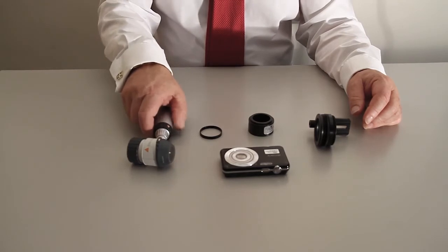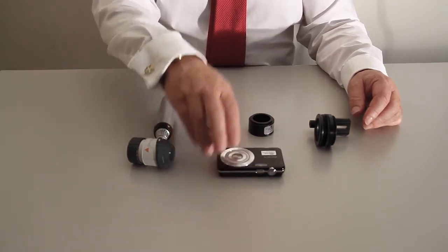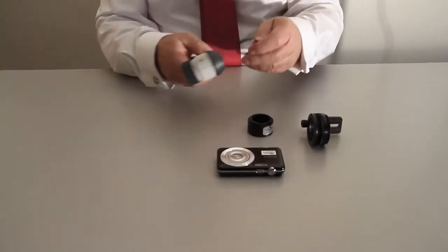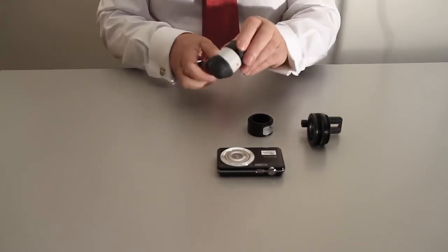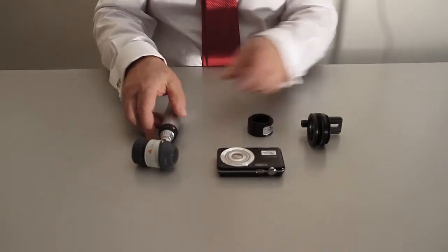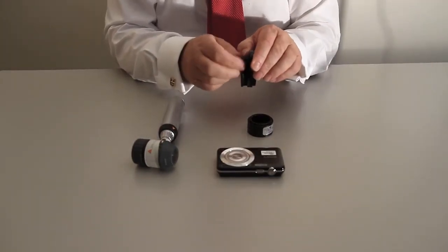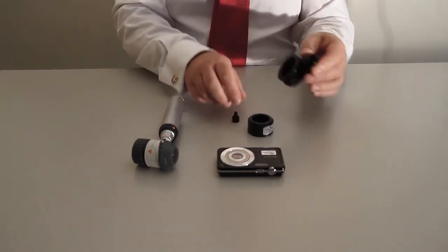And this is how you put together the digital camera package for the dermatoscope. So you've got your dermatoscope, the ring, the O-ring, the split ring, your digital camera, the sleeve and the connector. First of all, put your split ring on there, slip it on properly and push that down like that. This will come with the screw attached here. You just simply unscrew that. It's just there for storage. Put that down like that.